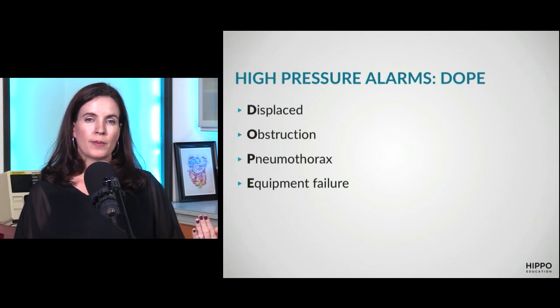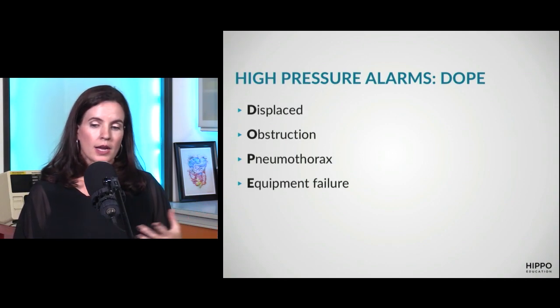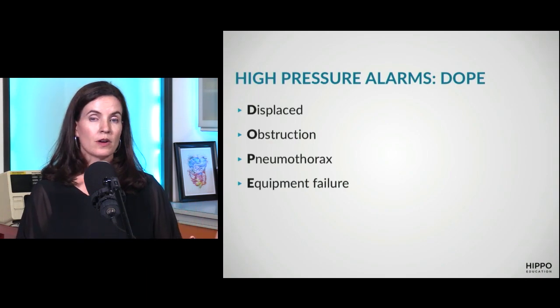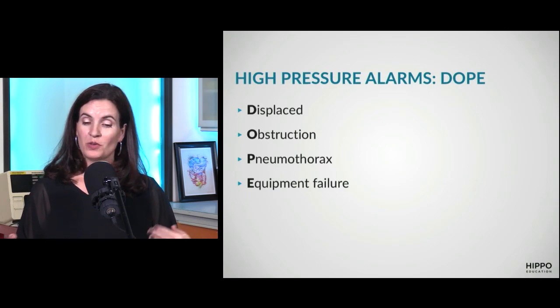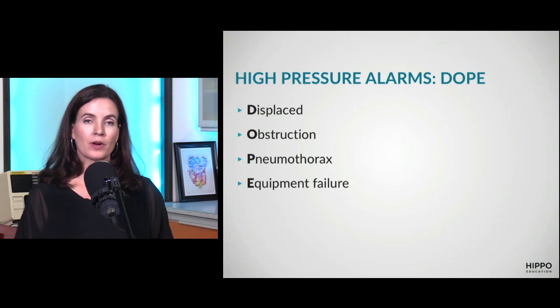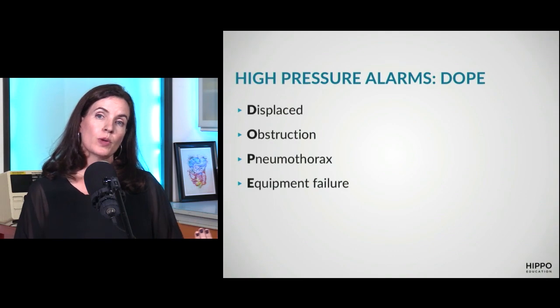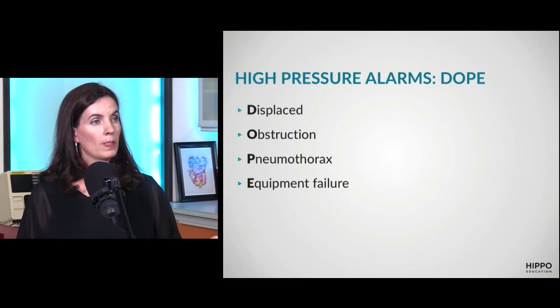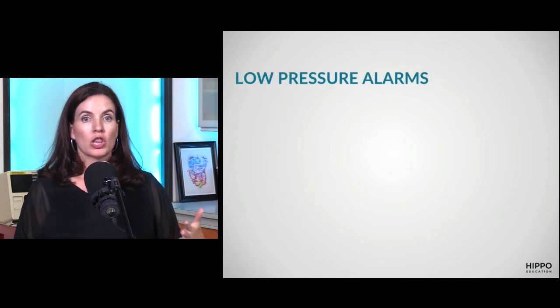So this does take us back to the critical step of, if you just can't get the vent to stop alarming, just take the patient off the vent and bag, right? This is always our safe backup move whenever the vent is driving you crazy. If you need to just turn it off, turn it off. It will be safe to bag your patient until someone comes to bail you out. But this is a quick and easy mnemonic to use to run through that high pressure alarm. Love it. Love it.